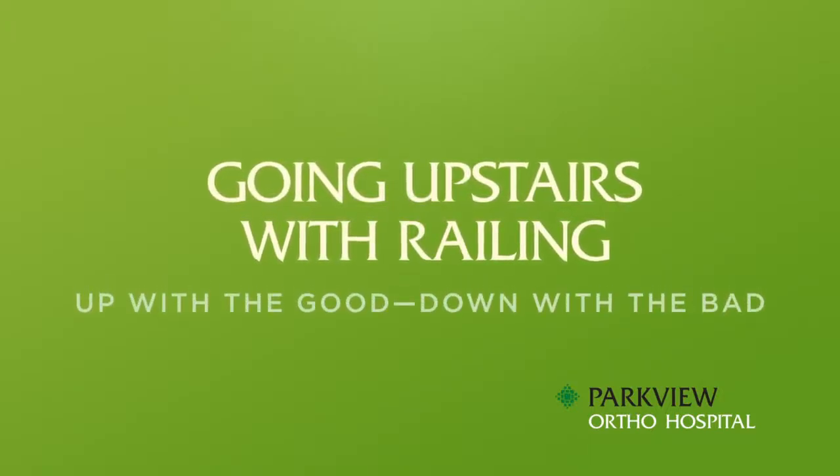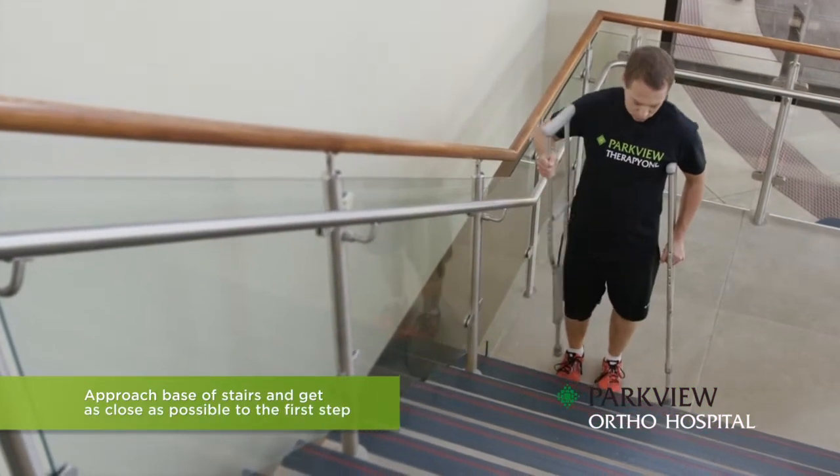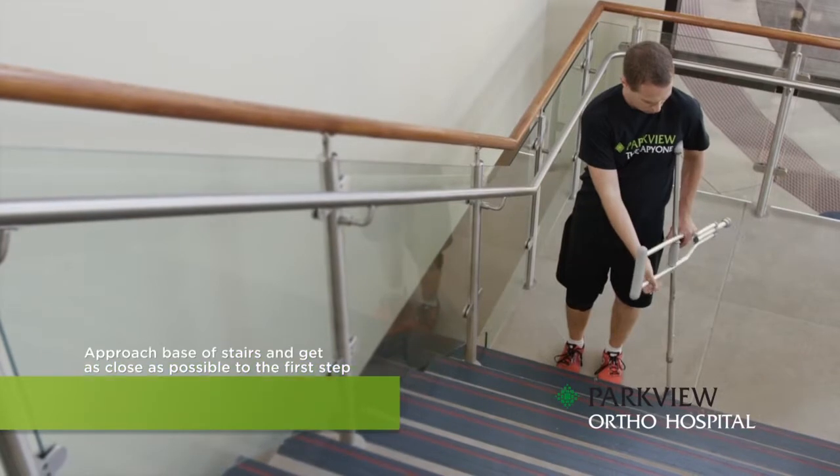Going upstairs with a railing. Always remember this rule: up with the good and down with the bad. Make sure you are only putting as much weight through your bad leg as was ordered by your physician. Approach the base of the stairs and get as close as possible to the first step.